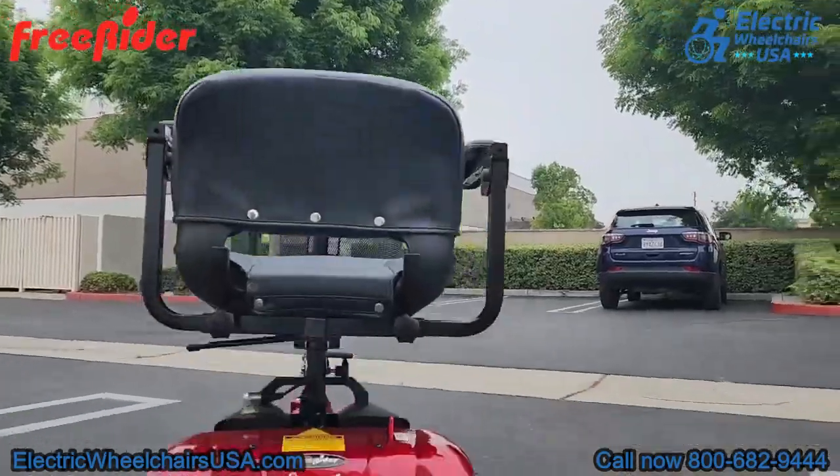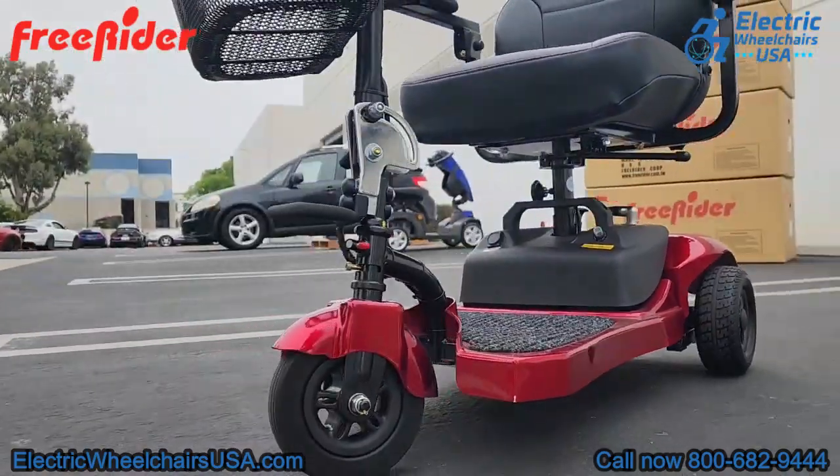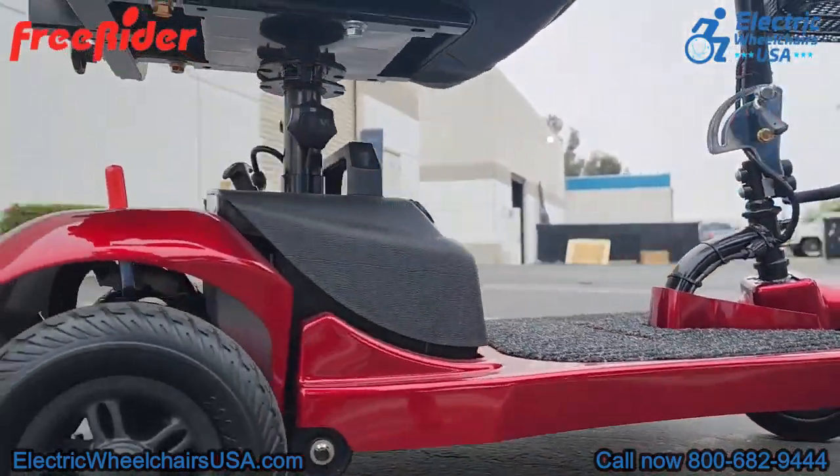All in all, it's a really awesome scooter — it supports a higher weight capacity than most portable mobility scooters on the market and has an all-around great feature set that many of our customers really like. We do recommend the Ascot 3.